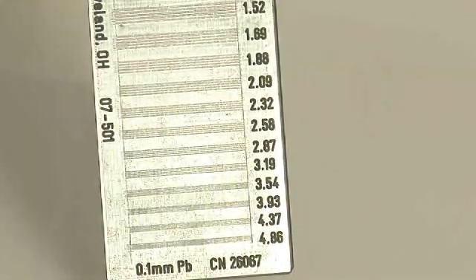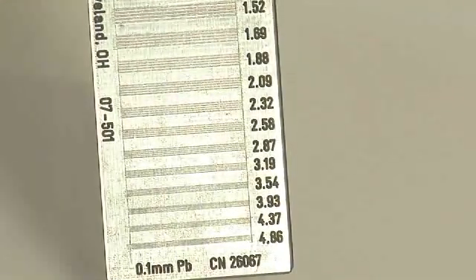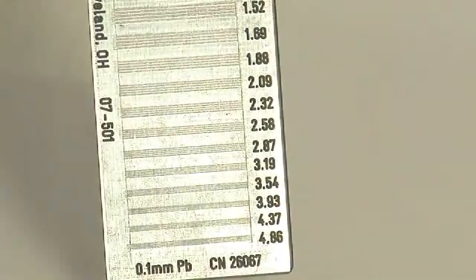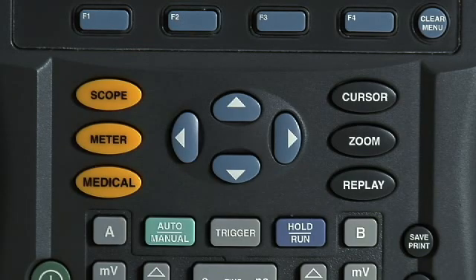The operator can select the video line of interest, 249 in this example, and scan the resolution test pattern. It's hard to discriminate resolution details from this image, so zoom can be engaged by depressing the zoom button once.